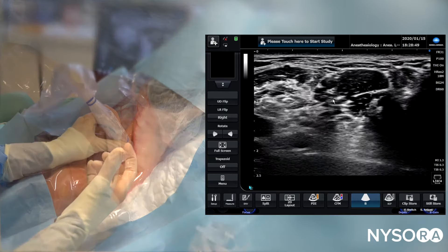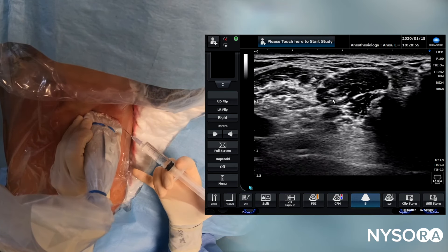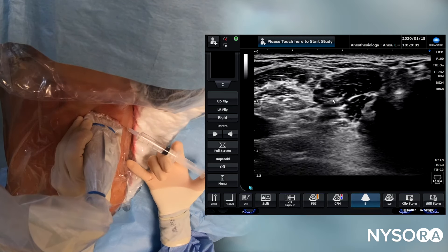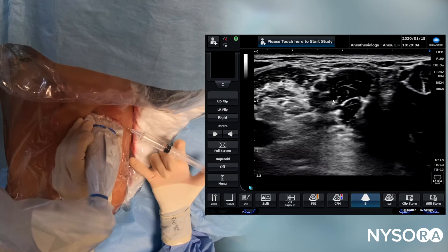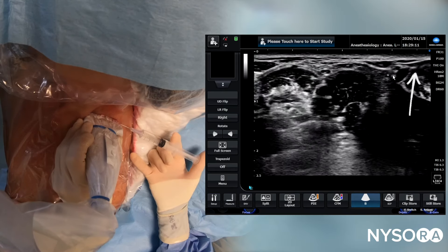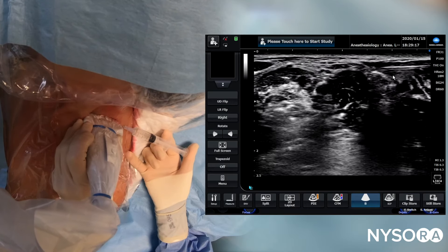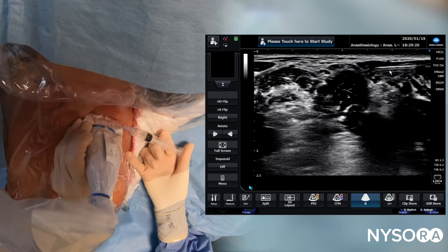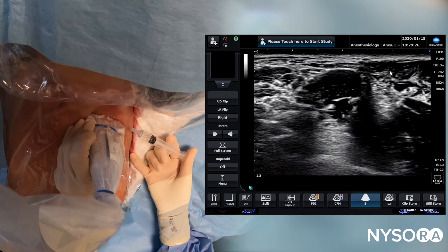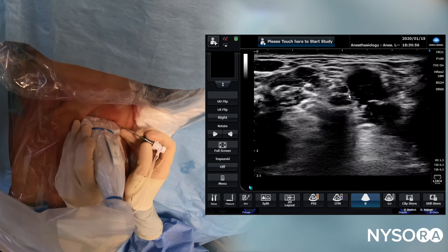The procedure starts with injecting local anesthetic for the skin, as we are going to use a continuous needle — an 18-gauge needle, usually a Tuohy-style needle for this particular procedure. We also use this opportunity to visualize the needle, because visualizing it gives an indication of what angle we will need to introduce the needle for the catheter. We use this as a seeker needle to get a rough estimation of the angle required to reach the brachial plexus.